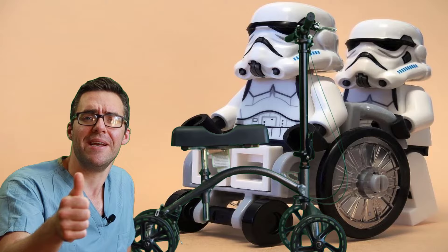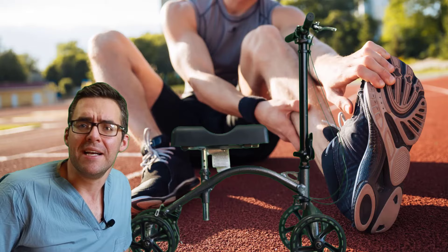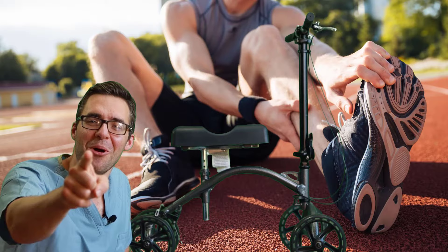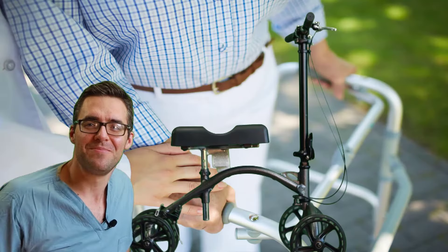See how this one has four wheels. Don't get those three-wheeled ones — those tip over forward and back. I see that with baby carriages too. Don't fall over, especially if you're older and can't move anyway, because you're not going to be able to use your foot to catch yourself. Get four wheels.